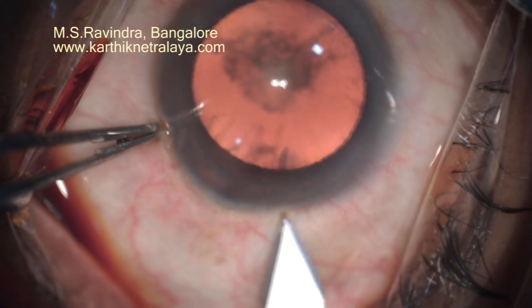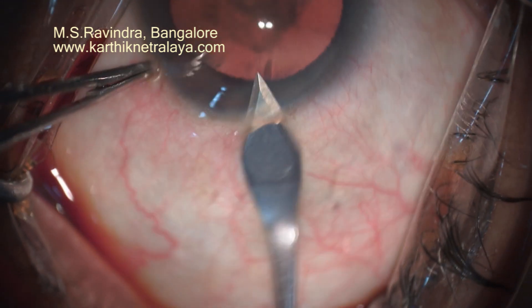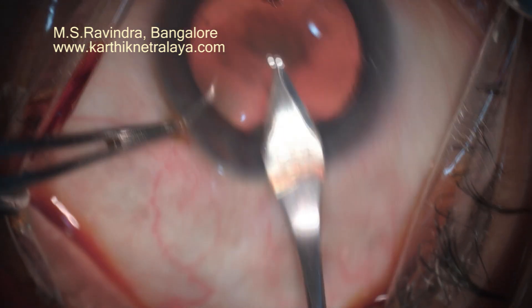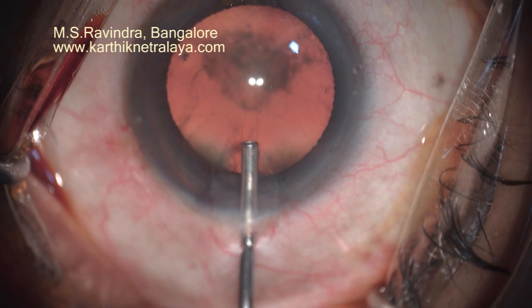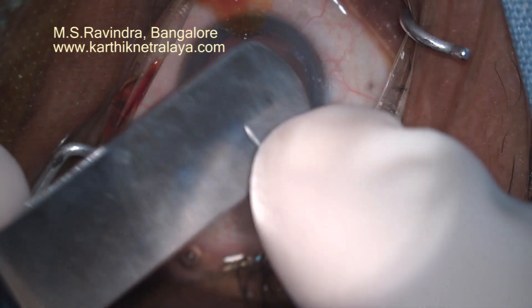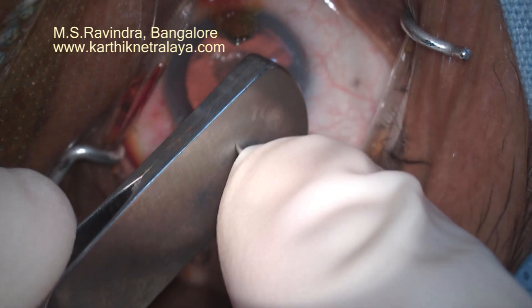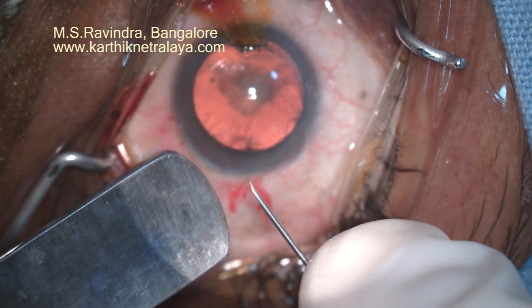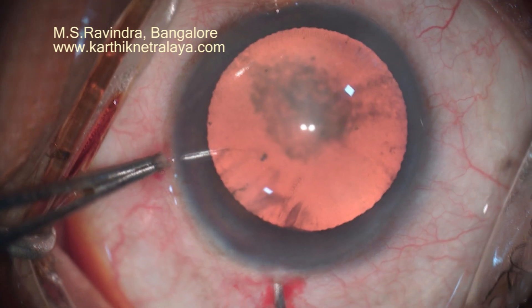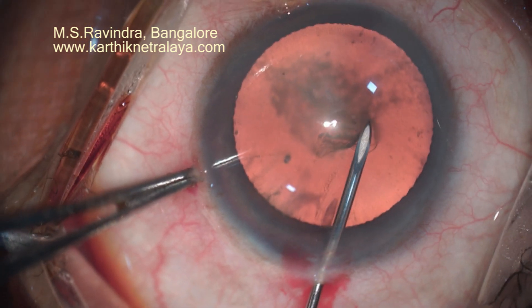The translimbal approach of doing cataract surgery is a possibility. The keratome enters at the junction of the limbus and sclera — sometimes in the peripheral sclera or in the limbus — where a 2.8 mm entry is made. A cystitome is created by bending it slightly to about 45 degrees, which perforates the floor of the tunnel at the limbus and goes into the eye.